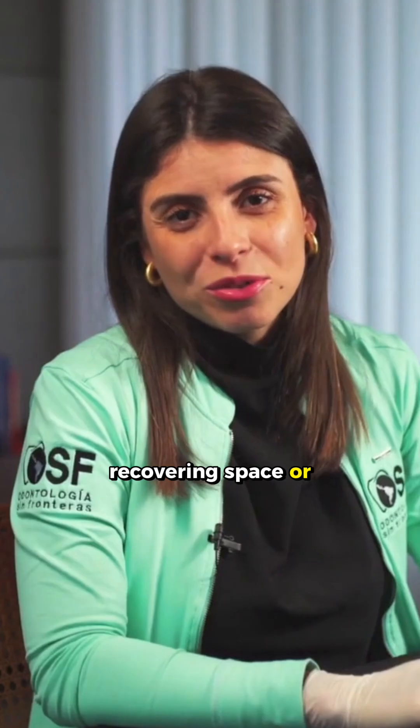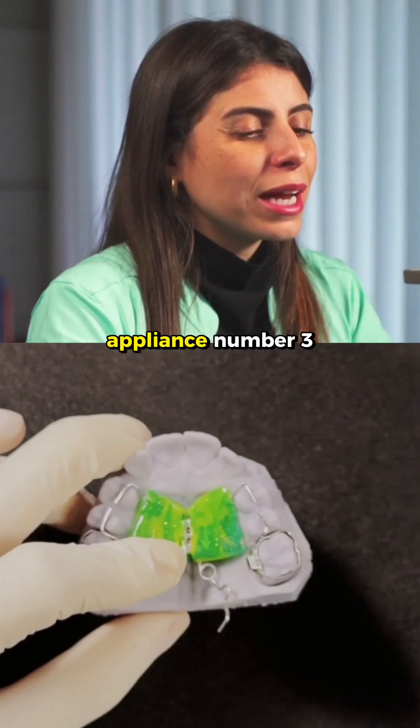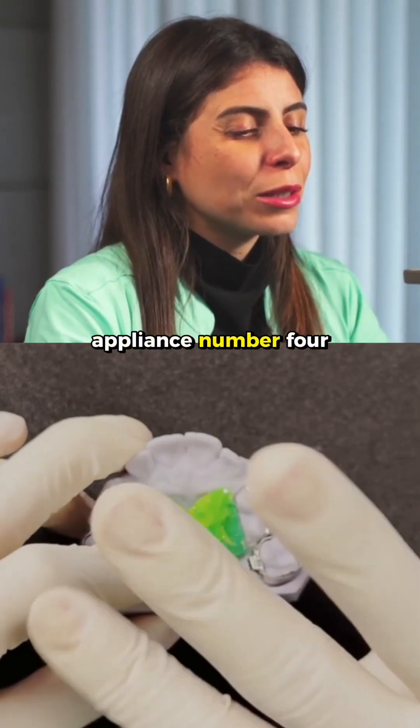This recovers space or corrects Class 2. Did you like this appliance? Then follow our series of 12 appliances. We are on appliance number 3. Stay tuned for appliance number 4.